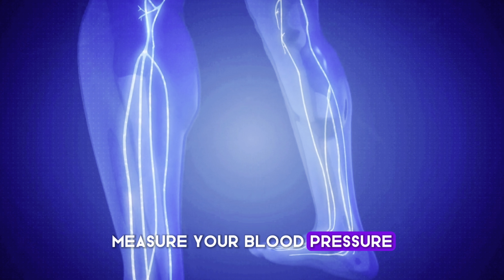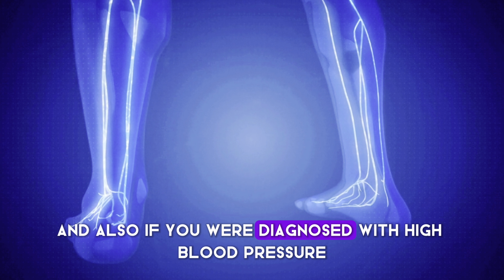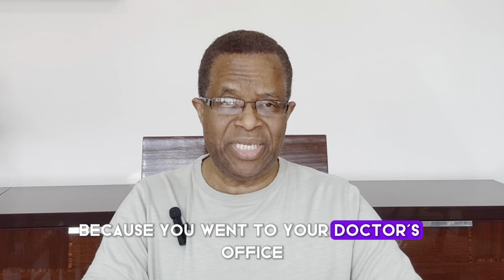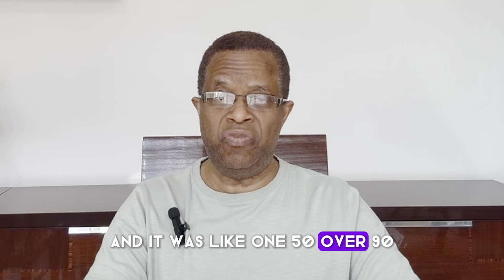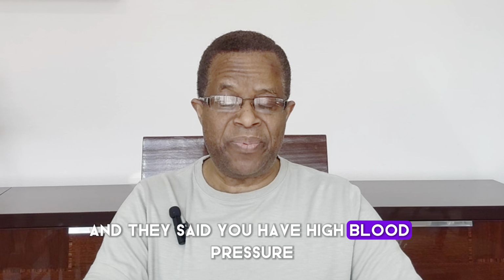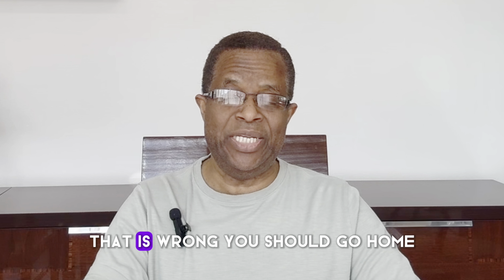So today I'll show you how to correctly measure your blood pressure. And also, if you were diagnosed with high blood pressure because you went to your doctor's office and they took your blood pressure only once and it was like 150 over 90, and they said you have high blood pressure and they put you on medication, that is wrong.